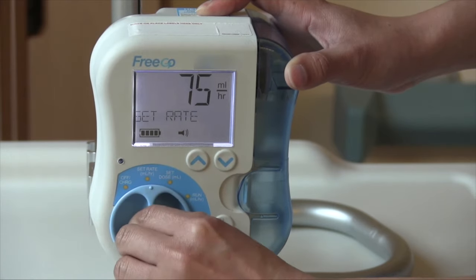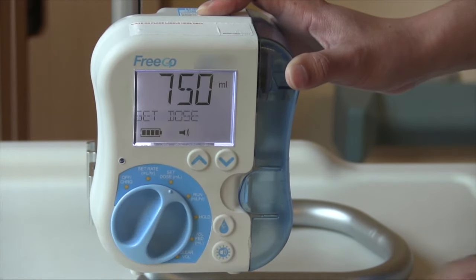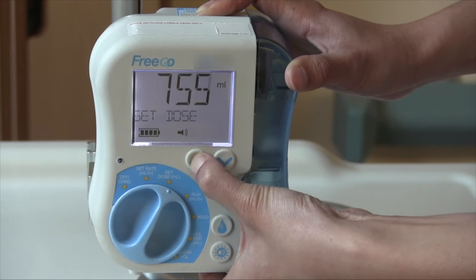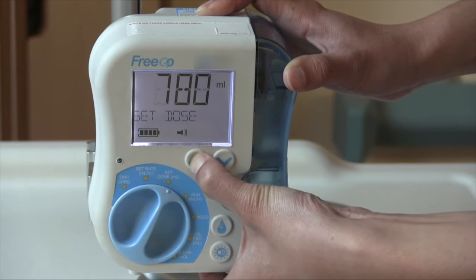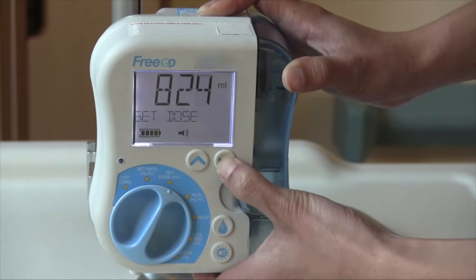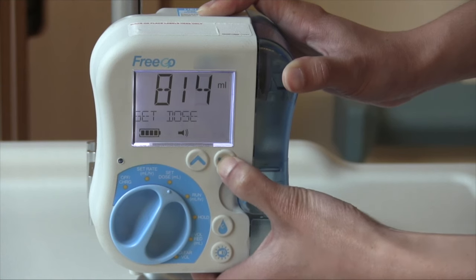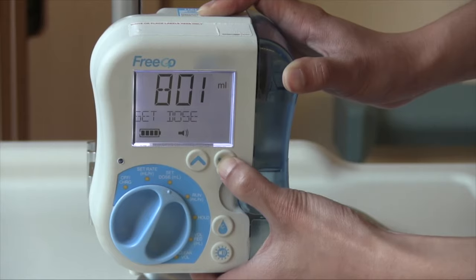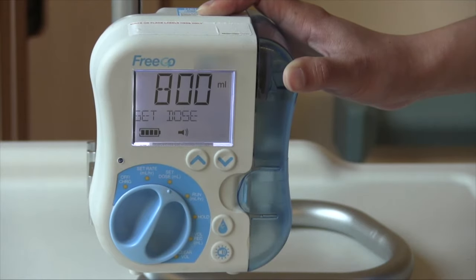After you have set the rate, we will set the dose. Turn your dial to set dose. Dose is the total amount of feed you will be receiving every time you feed. You and your dietician will talk about the amount you need to maintain your nutritional intake. For this video example, we will choose a dose of 800 mils. To adjust the numbers, press and hold the up and down arrows. We have now set your dose.